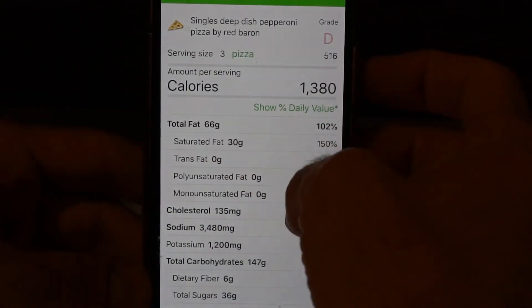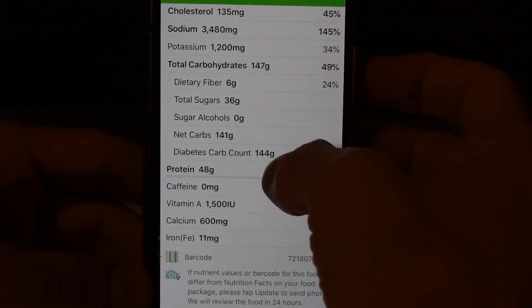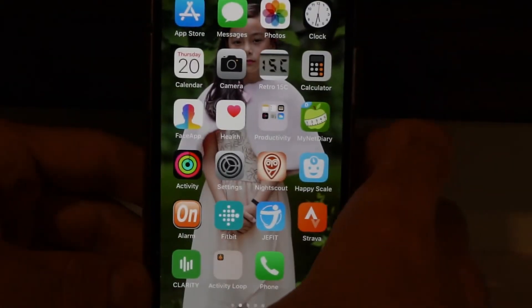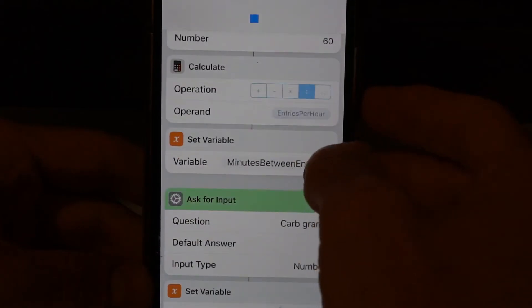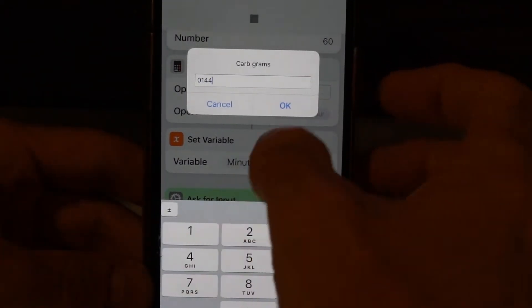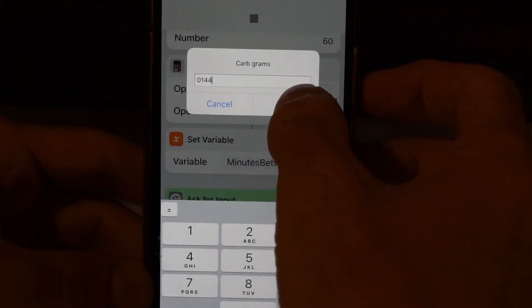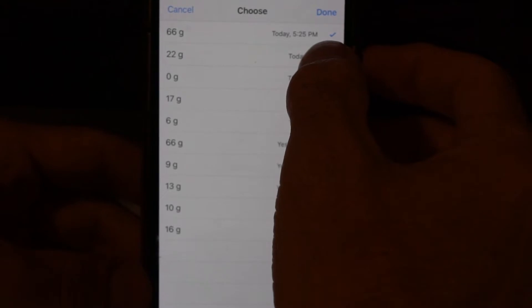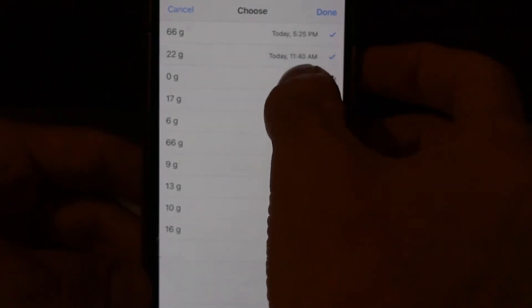You can see that this is 66 grams of fat, 144 grams of carbohydrate, and 48 grams of protein. Now if I start the shortcut, I enter in the 144 grams of carb — you have to do this part manually — but for the fat, it loads from Apple Health what the nutrition app saved there, so I can just click on the 66.